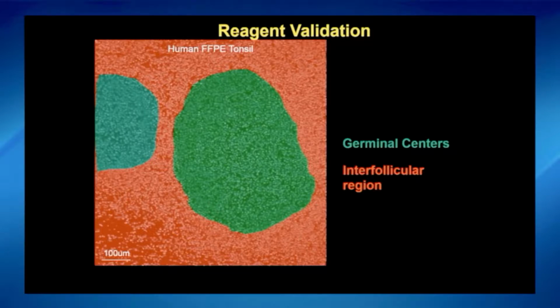So every primary antibody that comes into my lab, I make everybody, even though they kick and scream about it, do a chromogenic stain without derivatizing the antibody first to see if it works. If it does work, then we metal conjugate it, and then we test it again under the same titers to make sure it still works. And then if it does, we move it on to the multiplex panel with a MIBI analysis. And 95% of the time, if we have a primary antibody that's metal conjugated that works well with chromogenic IHC, it works great when we get it to this stage. So that's kind of abbreviated how we look at the reagent process.